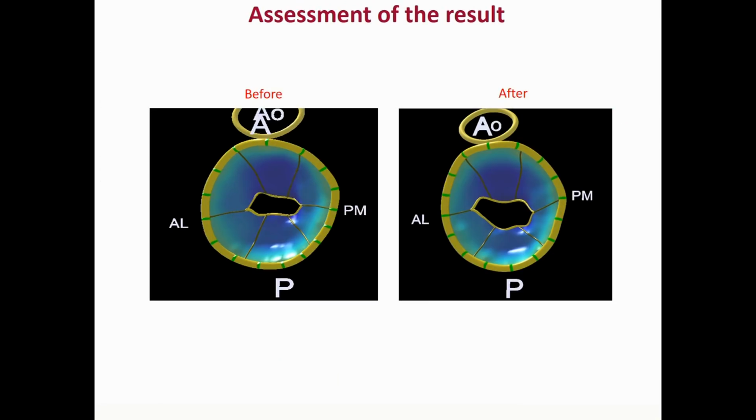And also you can use it in the cath lab in patients undergoing balloon mitral valvuloplasty, because those patients will have open commissures after the ballooning. These open commissures will definitely be at a different level than the tips of the mitral valve. So simple planimetry by 2D or even by the MPR-derived 3D planimetry will not consider the commissures, but this MVN method will take the commissures into account. This is before and this is after balloon valvuloplasty.